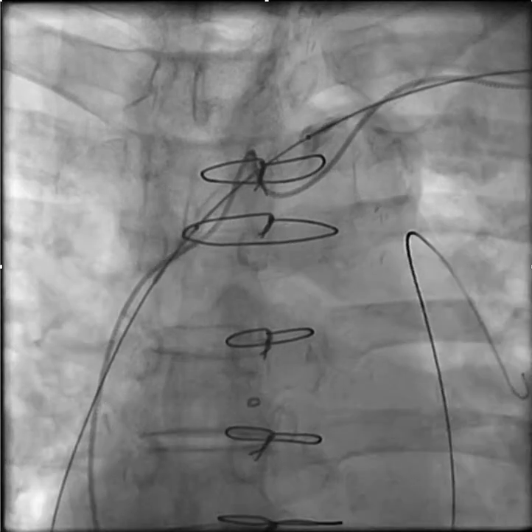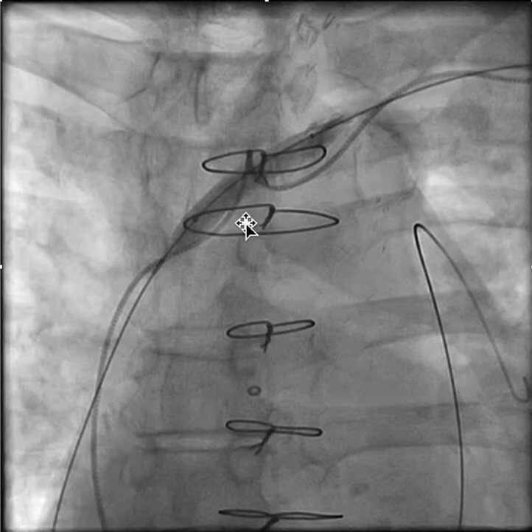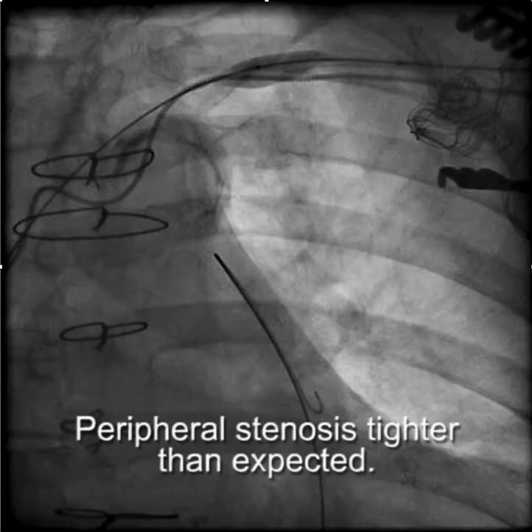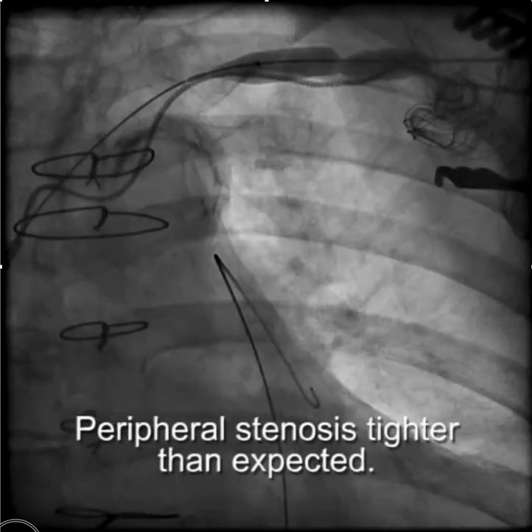But when the lead kept falling out, we realized that there might be more of a subclavian stenosis than we thought, and so we proceeded with venoplasty using a nine millimeter balloon. As you know, you start at the innominate/SVC junction and do head-to-tail overlaps until you see the tail of the balloon in the pocket. Here we have the final inflation.